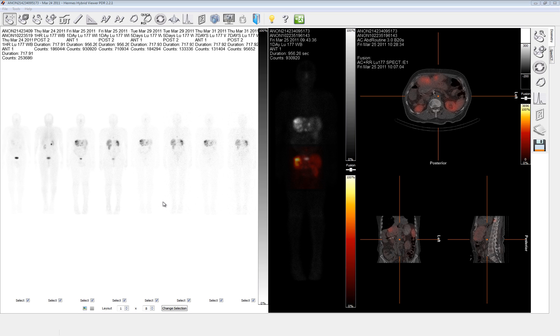Hello, this is Andrew Preeto with Hermes Medical, and I'm happy to show you today the use of our Hybrid Dose 2.0 program. This program is intended to streamline the processes of obtaining the residence time for each organ of interest to facilitate the MIRD-approved S-Factor dose calculations.